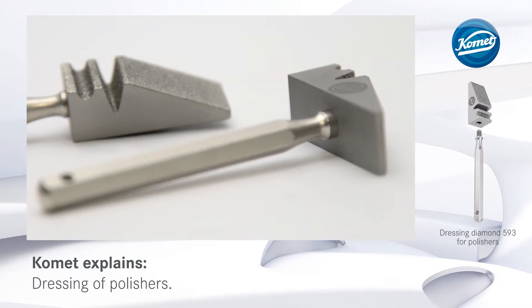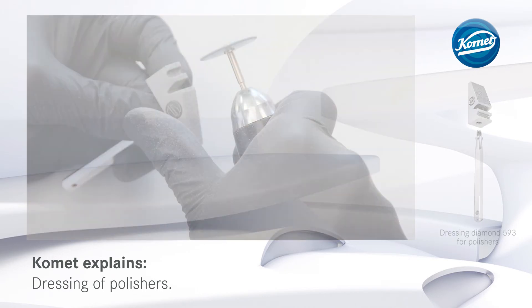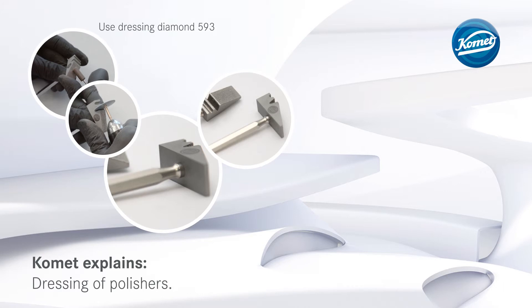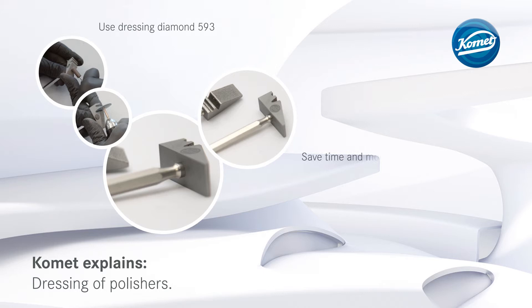This not only saves you money, but makes your daily work a lot easier as well. That's how you do it: dress the polishers on the Dressing Diamond 593 to save time and money.